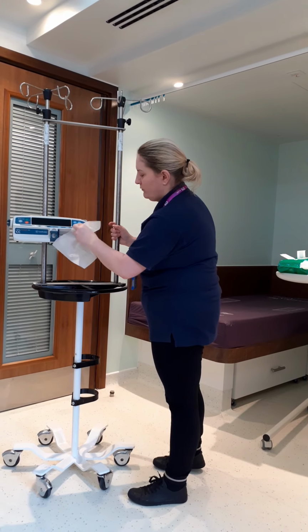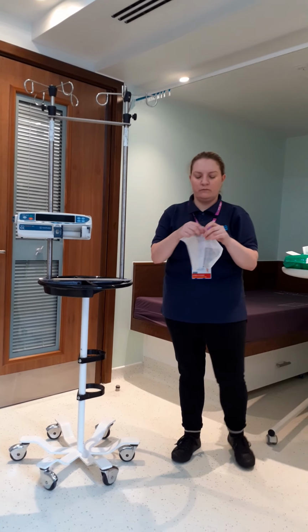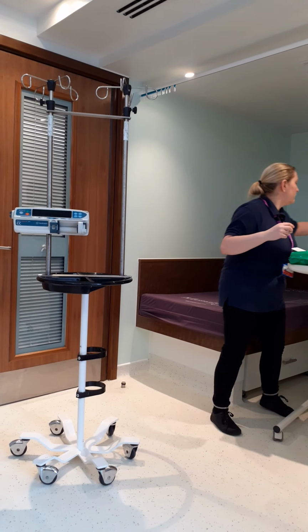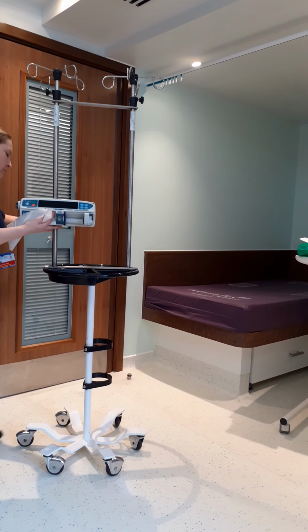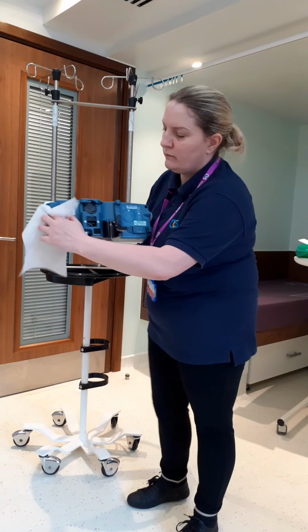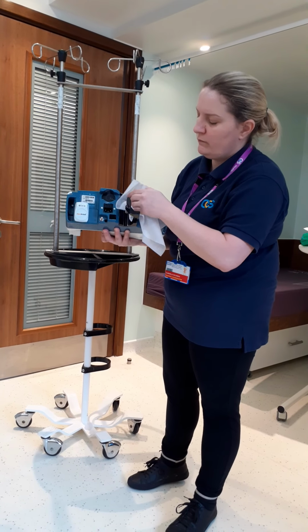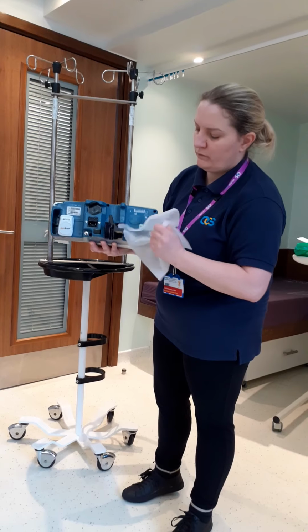For items that are textured, and especially those that have indents, it's really important to make sure that the entire object is cleaned, and so that we do go inside crevices and other pieces which may harbour dust and debris. As you can see, the back of this object is really quite complicated. Therefore, a standard S-shaped motion is not easy to undertake, but it's important to still make sure that you're applying a thorough cleaning to all of the surface, even if you can't do a standard S shape, and that you're not going back on yourself.